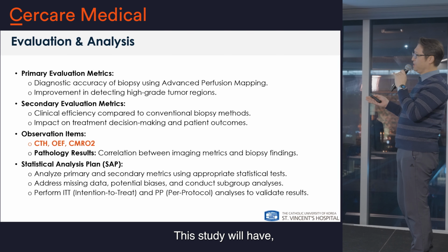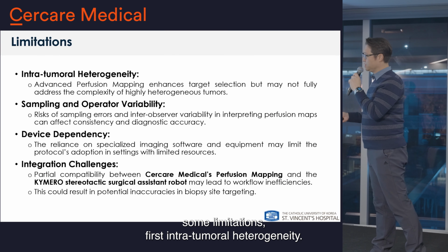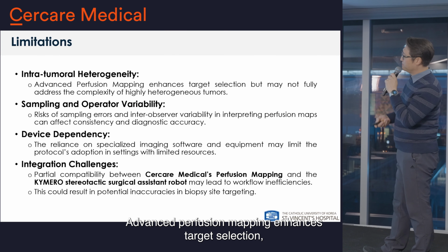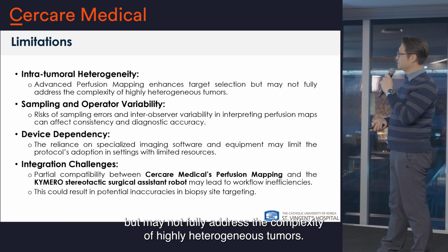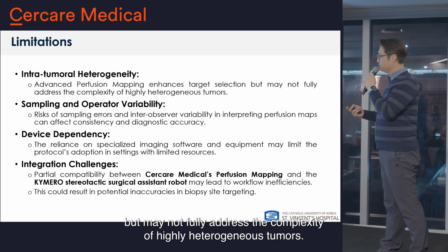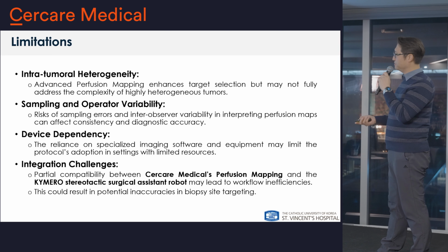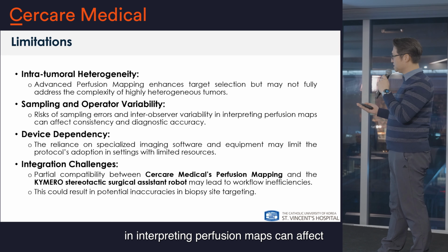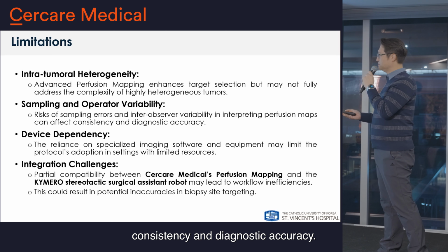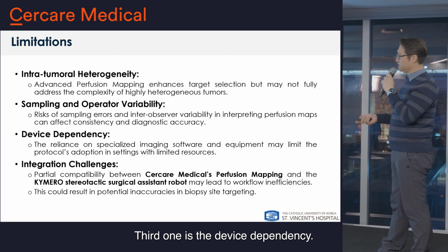This study will have some limitations. First, intratumoral heterogeneity. Advanced perfusion mapping enhances target selection, but may not fully address the complexity of highly heterogeneous tumors. Second is sampling and operator variability. Risk of sampling errors and inter-observer variability in interpreting perfusion maps can affect consistency and diagnostic accuracy. Third one is device dependency.